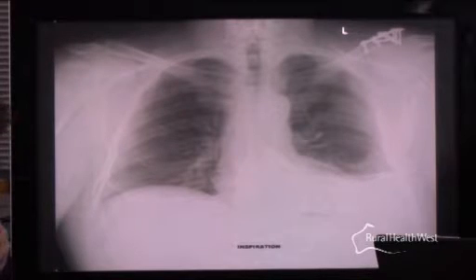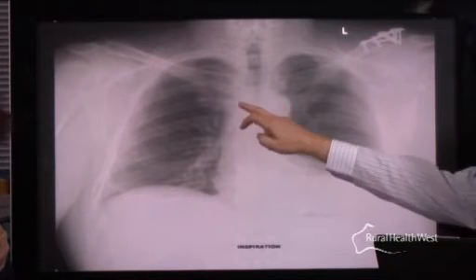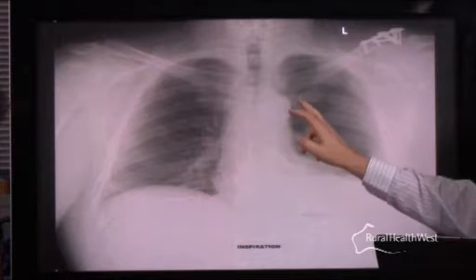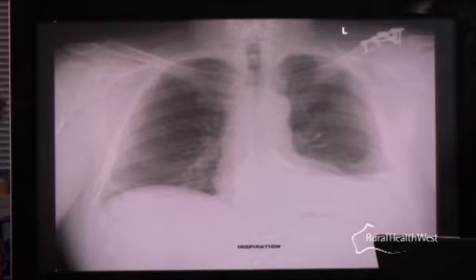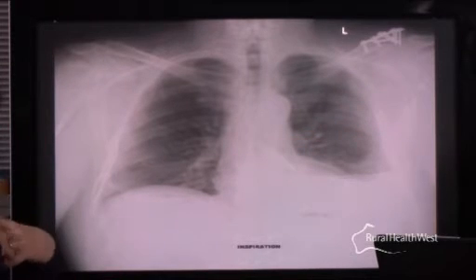Looking at the chest X-ray, the first thing to note is the heart size is probably within normal limits. There's fluid at the lung base, which makes it difficult to see. One thing to look at initially is the mediastinum, to make sure that if he's been in an accident there's no widening of the mediastinum, which might indicate that he's injured his thoracic aorta, and there's no suggestion of abnormal widening. As you go out through the lung fields, you can see that there is some loss of volume on the left as compared to the right, and I can see something that looks like a great big rib fracture in the middle there, or two, yes? Yes, or three. Here and here? Yep. Oh, and this one? So there are fractures there and there, so there are several rib fractures.